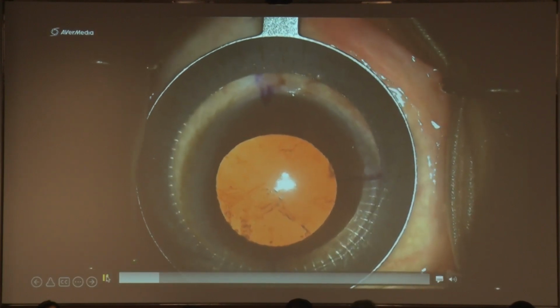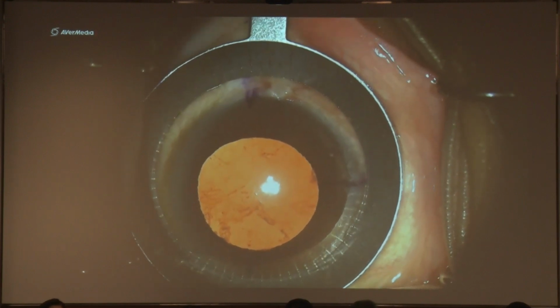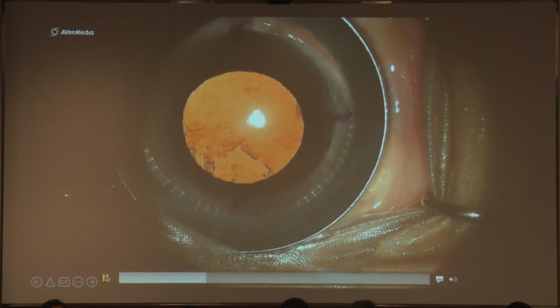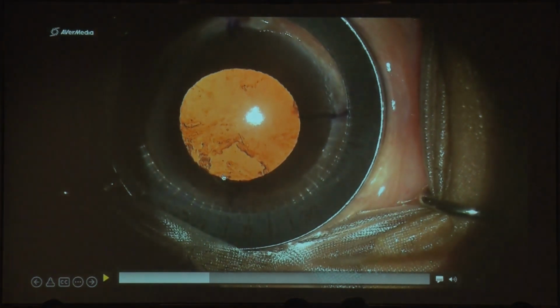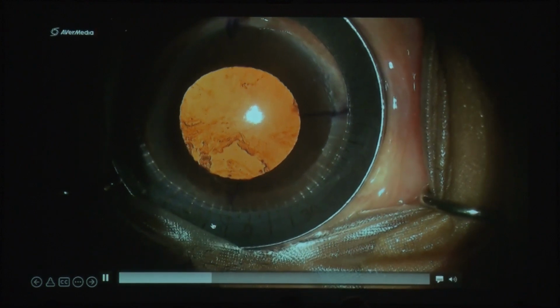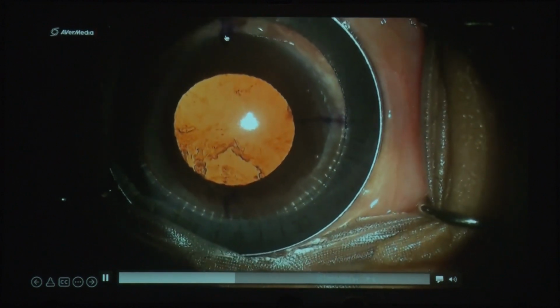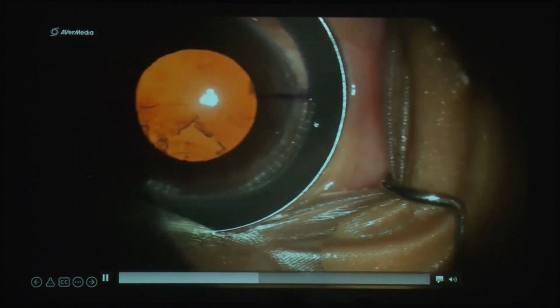Can I stop this video once again? Let me. 0 is somewhere there. Yes. You can see that your 90 degree is matching, but 0 and 180 degrees are not matching. But here the 0 degree and 180 degree are basically at the same parallel distance from this mark. So let's validate that my 90 degree marking is perfect.